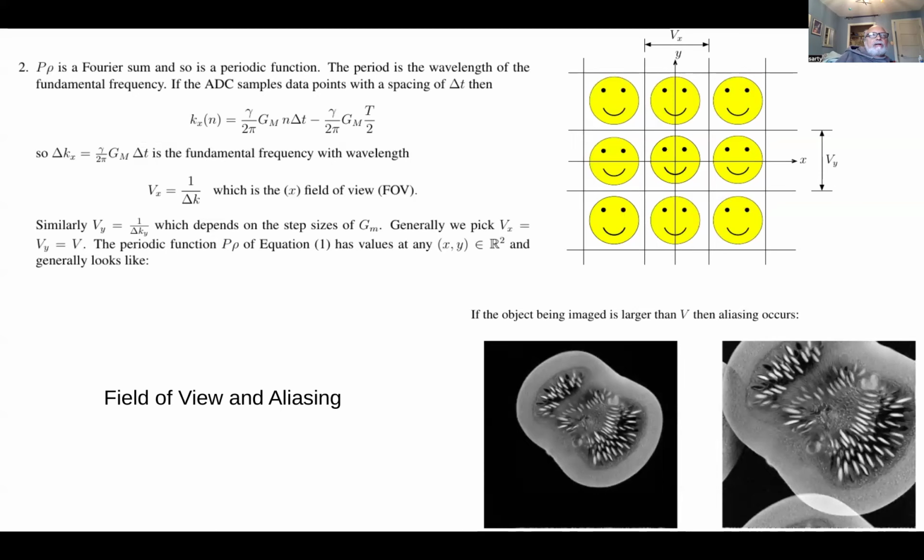If you're going to image the heart, you have to image the whole cross section of the body, so that your field of view has to be that much larger. So your heart's going to be this little thing in the middle of this larger section. And the only way to get around that is to improve your resolution so that you can actually just look at the heart in more detail. And to improve the resolution, you've got to go further in k-space.